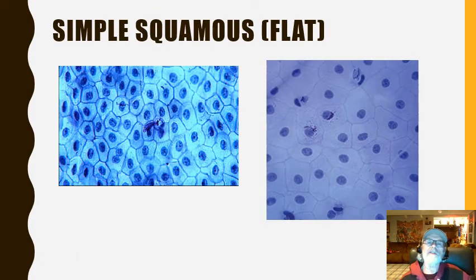Let's look at this photomicrograph showing squamous cells. If you look, they look flat, like a bunch of them just sort of paved together. It's basically one layer of cells thick, and here's a cell right here. Here's one, it's next to one here, which is next to one here, and they all look very flat. The same thing over here. Here's the nucleus we see inside the cell right there. There's a little difference in shape, depending upon how they fit with each other, okay? But that's basically what we call a simple squamous.